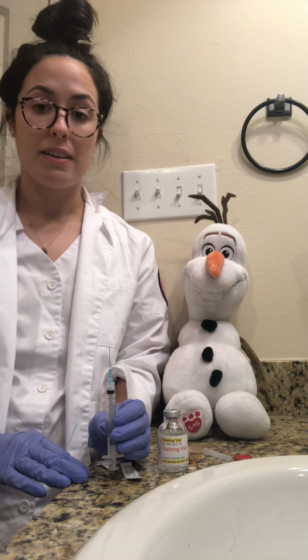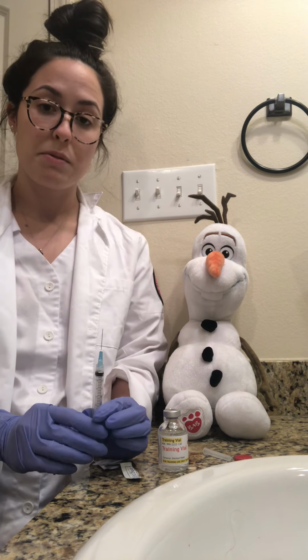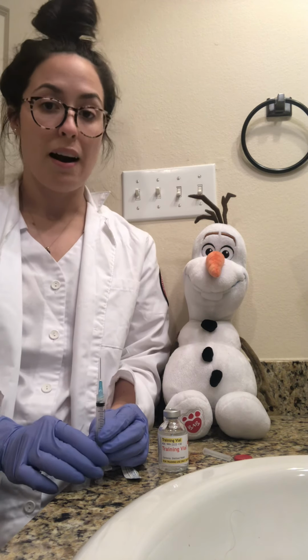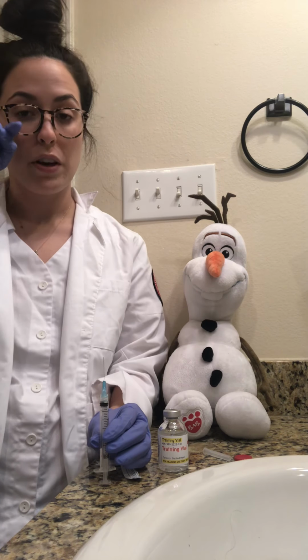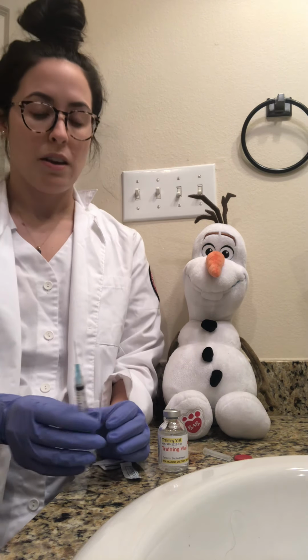So this particular medicine is 1 milliliter per 1 kilogram. Mr. Olaf weighs 2 kilograms, so we'll be giving 2 milliliters total of this particular medication. And the route is, like I said earlier, going to be IM, and we're going to particularly go into the deltoid muscle, which is on the shoulder. But you could also choose the lateral thigh or the posterior hip if you'd like also.